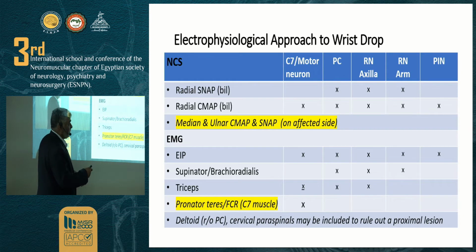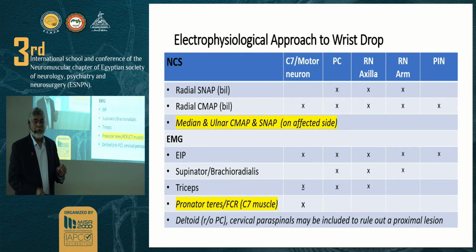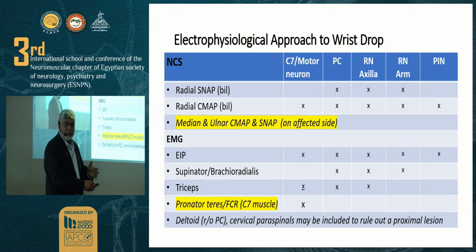But it will be proximally at the root level or the anterior horn, or more distally, it becomes pure. So radial sensory responses are an excellent localizing feature in radial neuropathy versus radiculopathy. We look at it very carefully, we do side-to-side comparison. Okay.